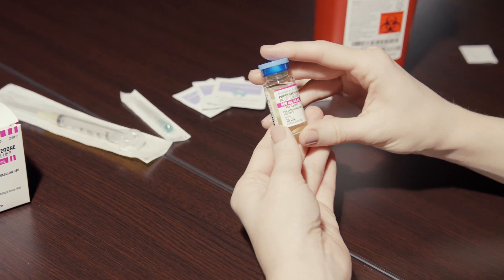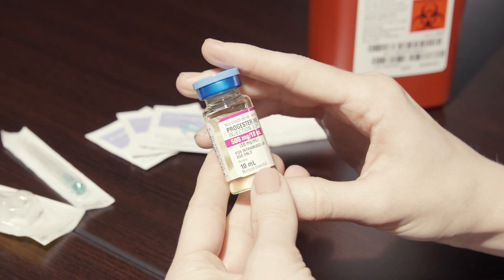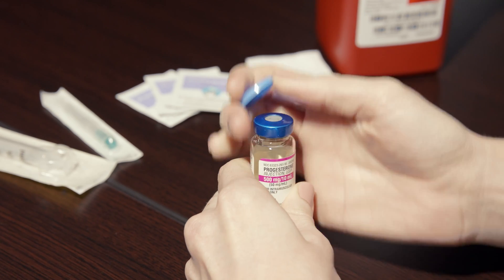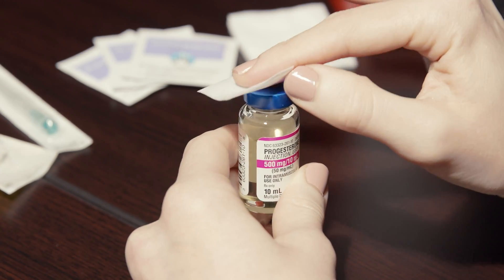Make sure that the vial of progesterone and oil does not contain free floating particles. Remove the cap from the vial of progesterone and oil. Wipe the top of the vial with an alcohol prep wipe.